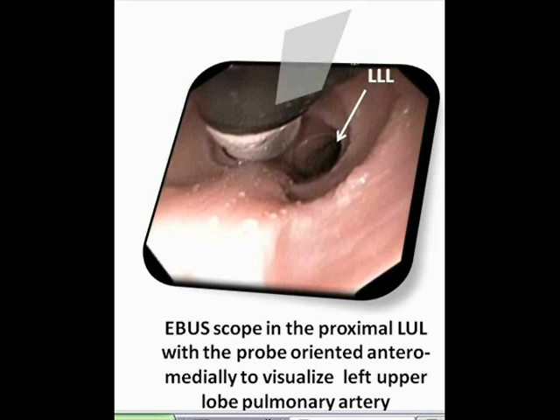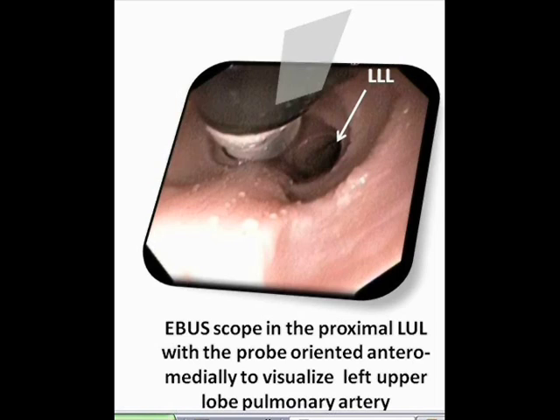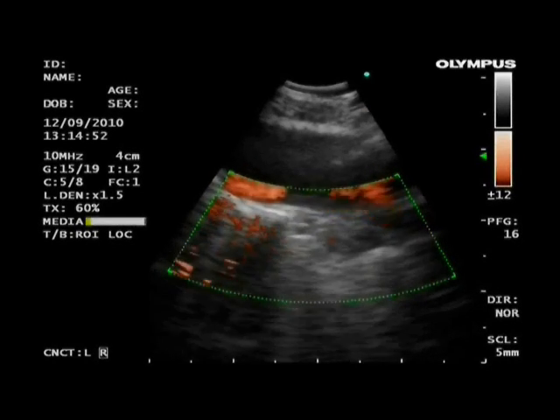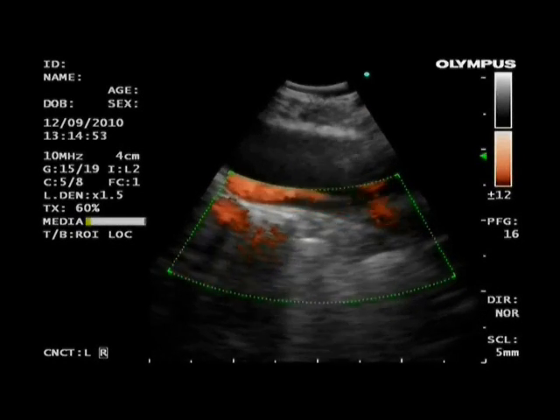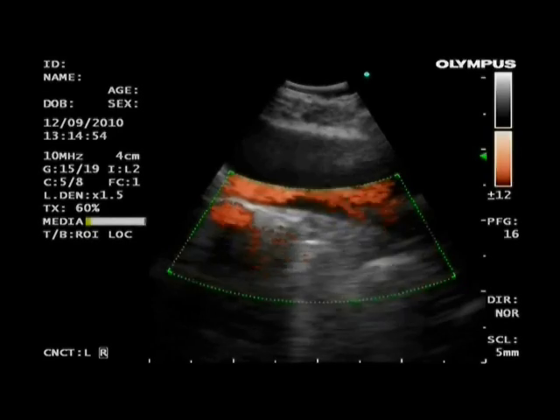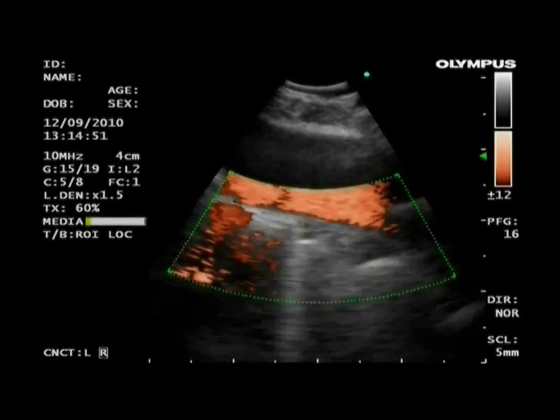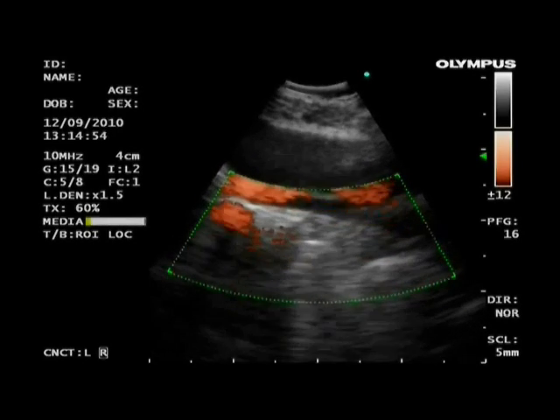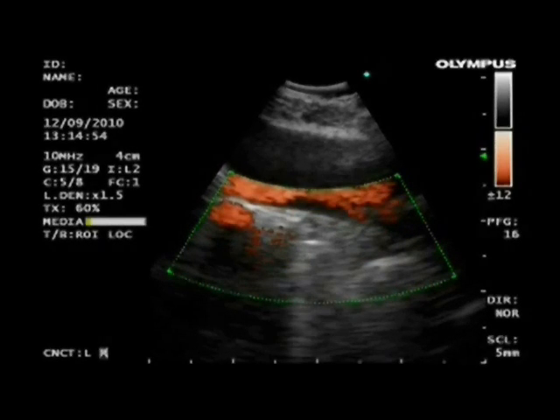The left upper lobe pulmonary artery is seen by placing the scope in the proximal left upper lobe and rotating the transducer anteromedially. This video shows part of the left upper lobe pulmonary artery in Doppler mode, adjacent to Doppler negative lung parenchyma and motion artifact.